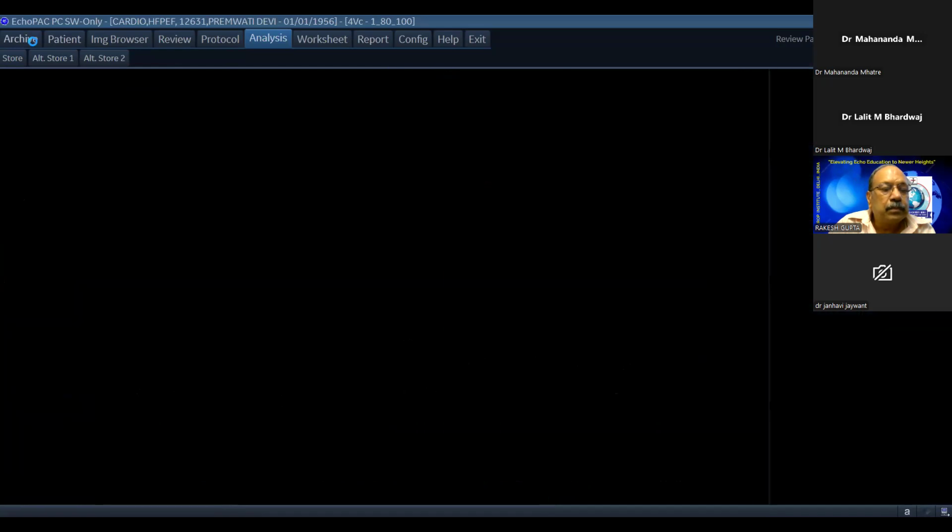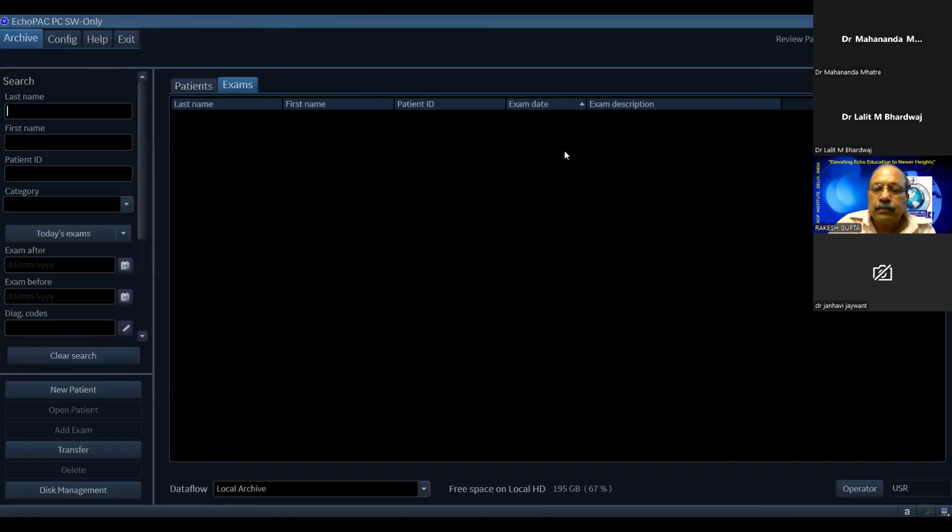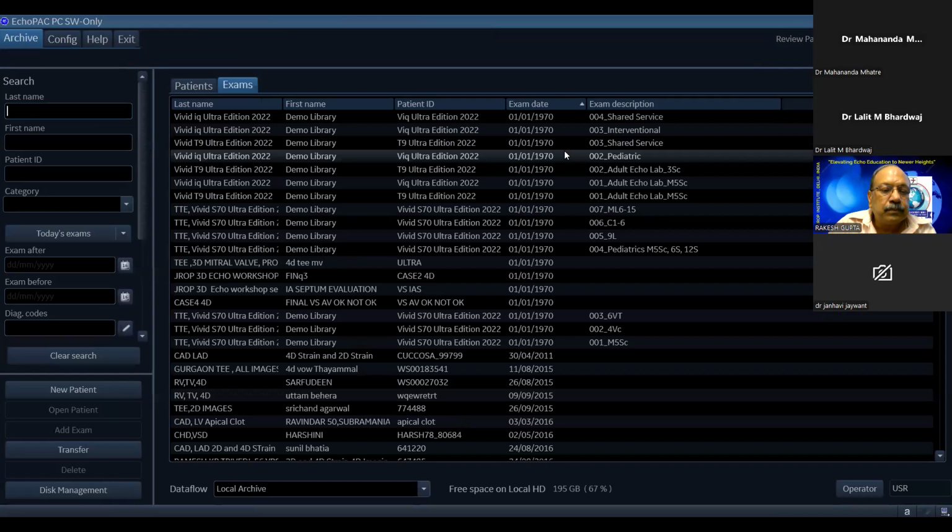So two questions. Color flow propagation velocity, then hepatic vein Doppler study and pulmonary venous Doppler pattern. We have to see grade 3 and grade 4 diastolic dysfunction patients, because hepatic vein sample volume, I had seen very few hepatic vein patients.